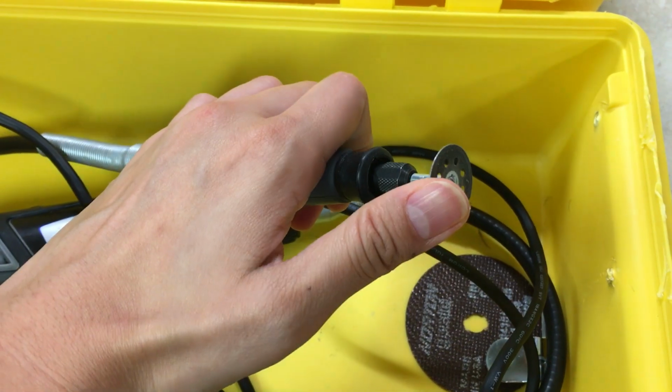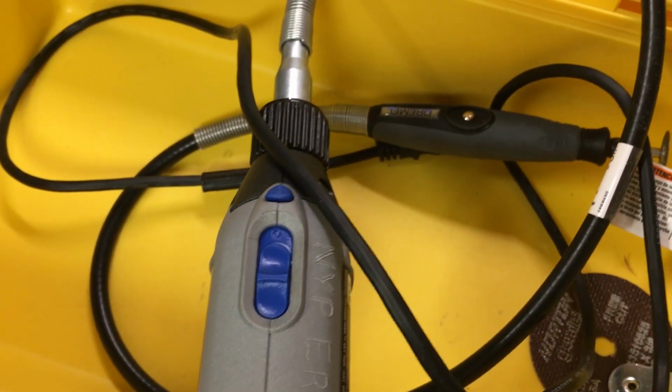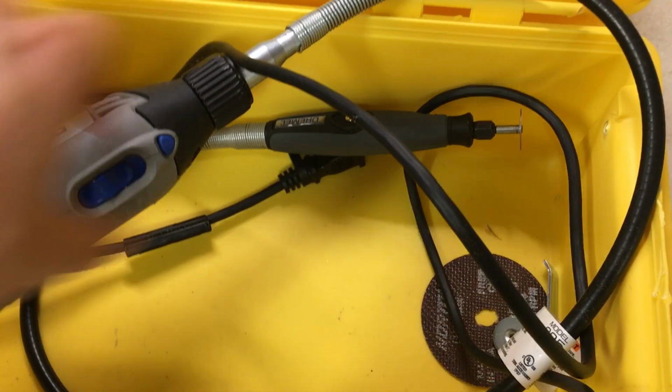There's also an electrical ring cutter that many emergency departments carry. If you're using this, you have to make sure to protect the skin underneath by placing a thin metal object such as a malleable retractor between the ring and the finger. Some ring cutters may have their own protective metal guard that you can use. So you want to place the thinnest part of the ring towards the palm of the hand and use an electrical ring cutter with the palm facing up.